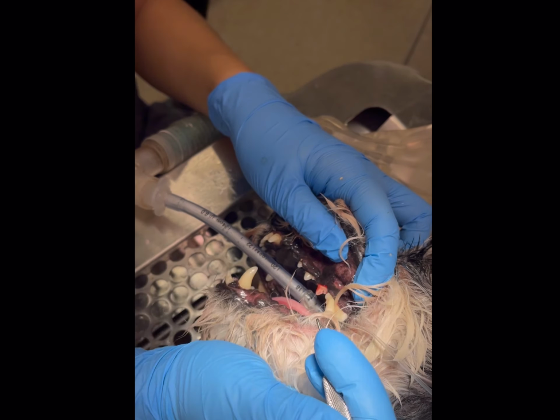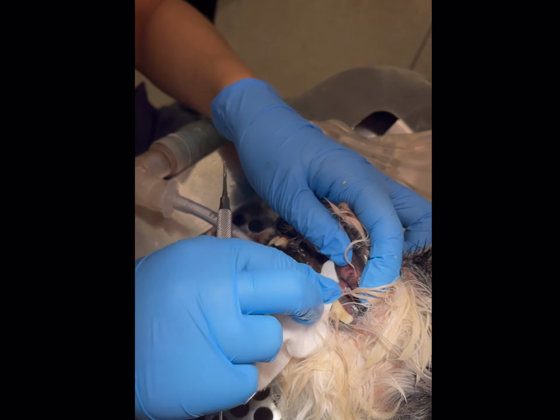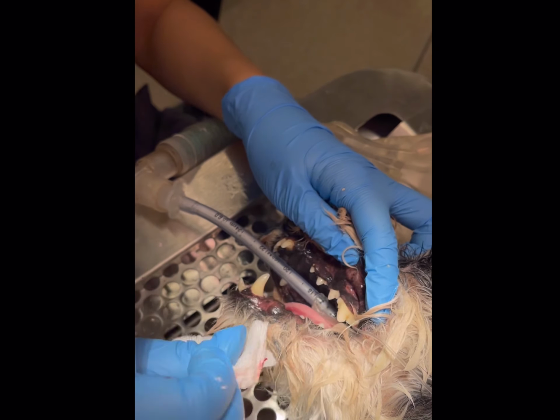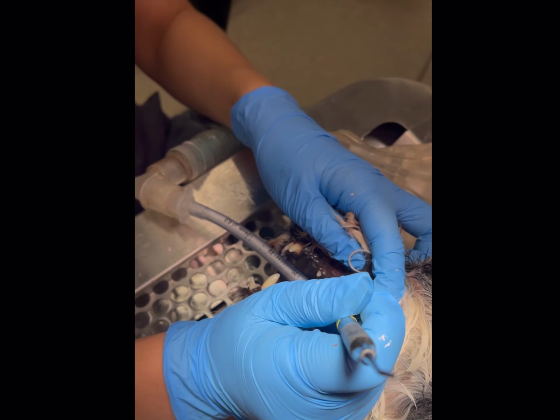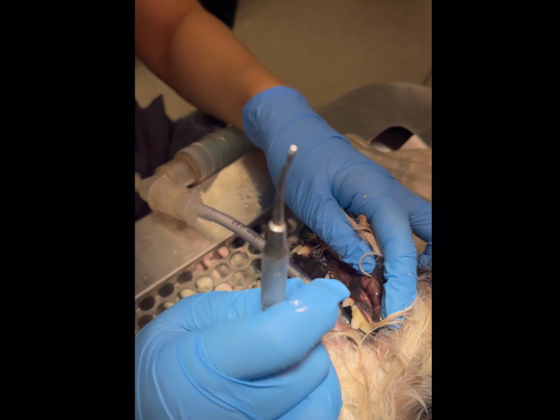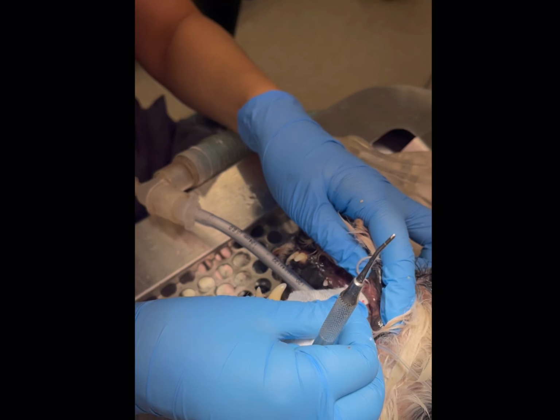So that's why we have them under anesthesia, so we can get a good look and a good probe of their teeth, because I don't even think the friendliest dog would let us do this. We're gonna go ahead and extract that, and that should fix the swelling under his face.